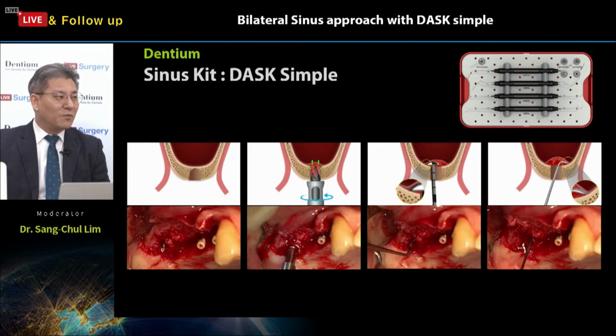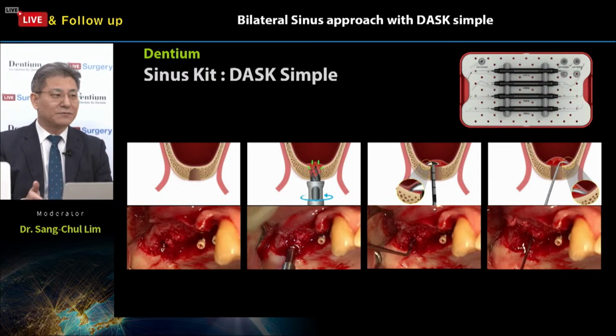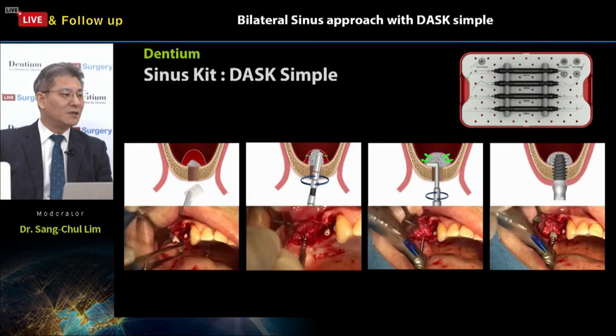Just a brief introduction of the sinus kit. This one is DASK Simple, as I mentioned before, the compact version of DASK Original. So what's new? The sinus curette is a smaller size than the original version, and the crestal drills are skipped, the drills being like a reamer style, and a graft spreader is added to this kit. This is the grafting situation using the graft spreader. Actually, this instrument is optional, not mandatory.